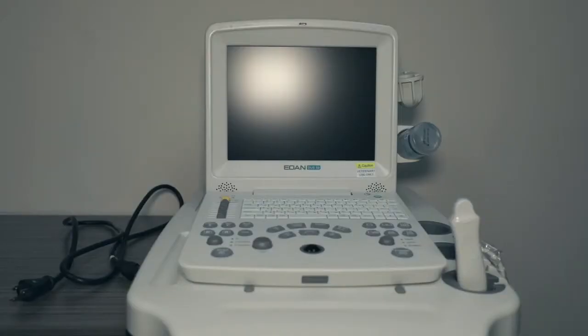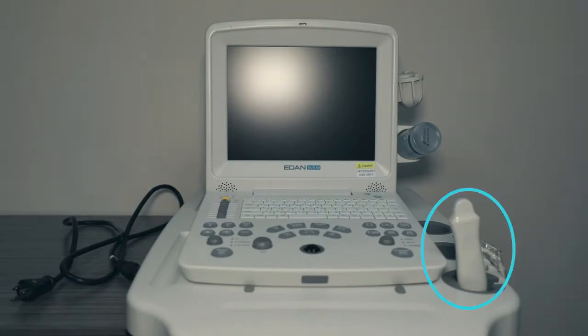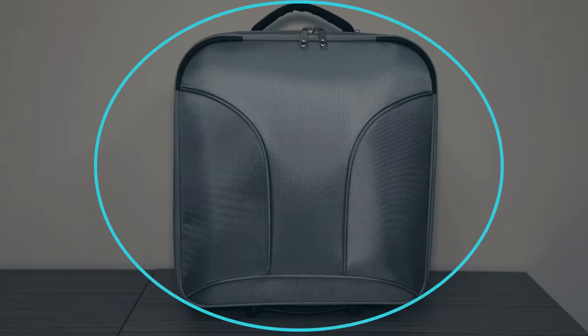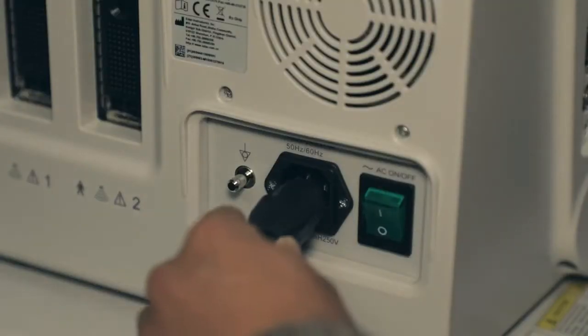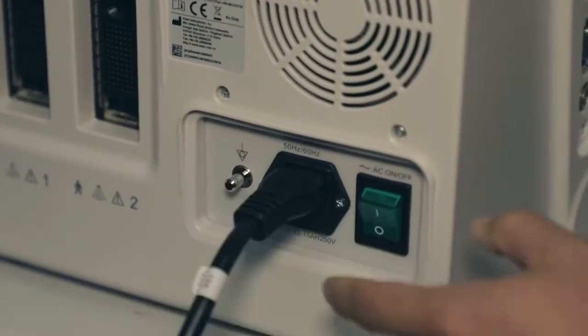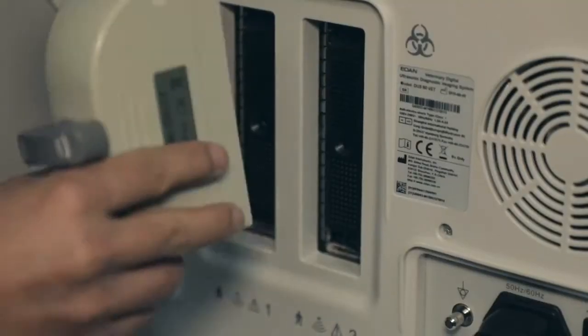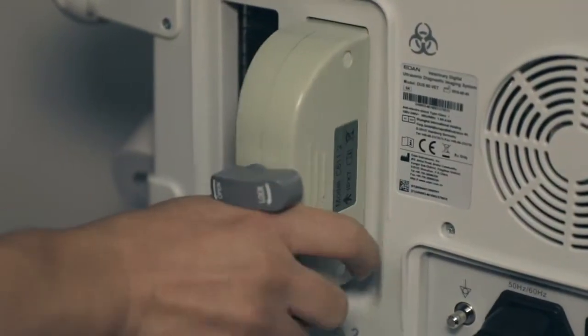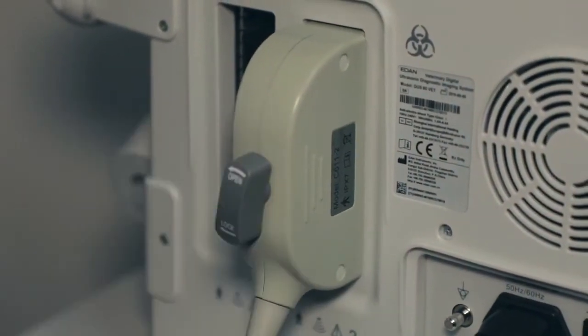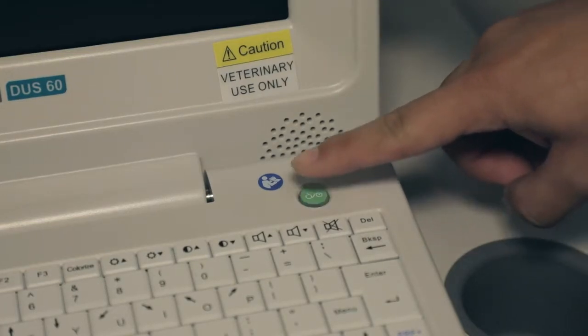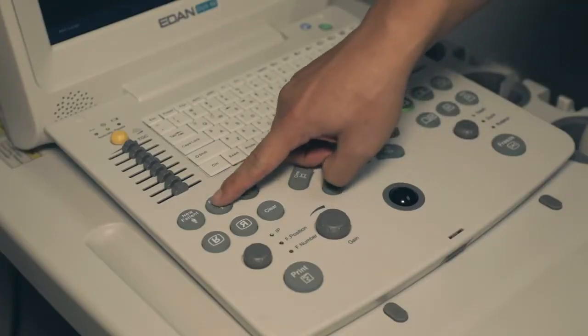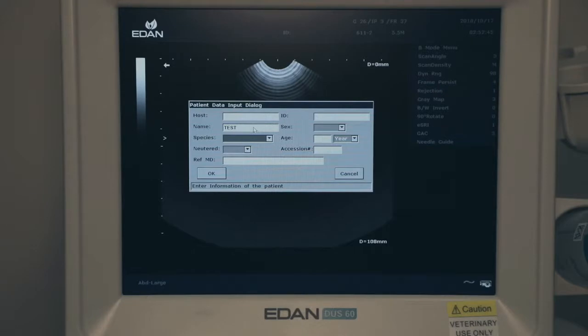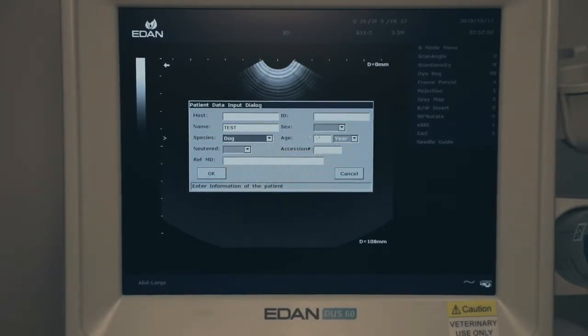DUS 60 consists of main unit, probe, power supply, trolley, and suitcase. Connect power cable, plug probe into connector and lock. Power on the system, press patient information key, and input animal type, sex, age, and name.